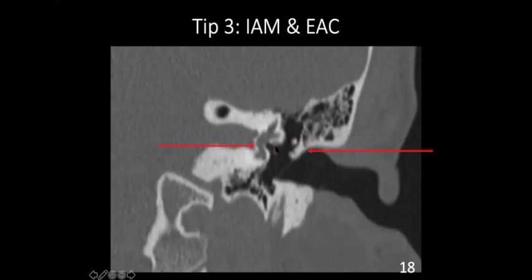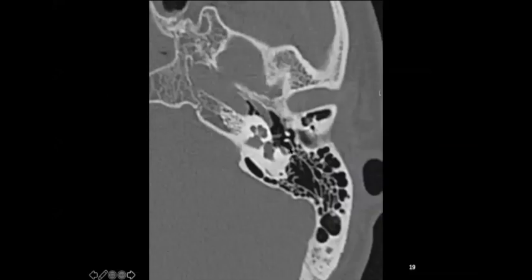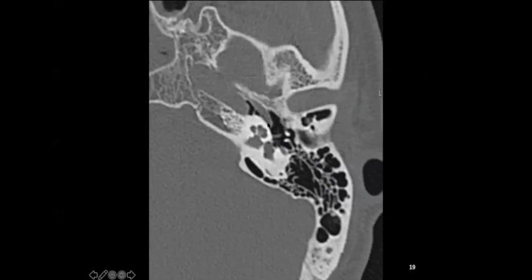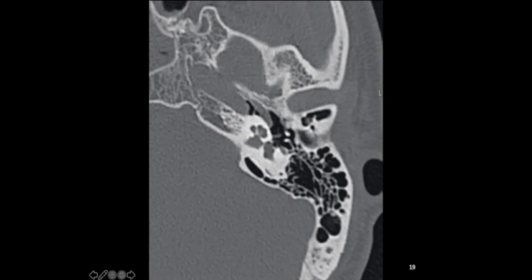The oval window is also present at the same plane. You can see the stapes here — both the anterior and posterior crura of the stapes and the stapes superstructure if you look carefully. This plane — where the floor of the internal auditory meatus meets the roof of the external auditory canal — corresponds to the level of the oval window, the horizontal facial nerve, and the vestibule. The horizontal facial nerve runs backwards at this level.